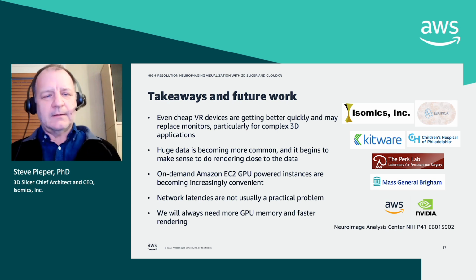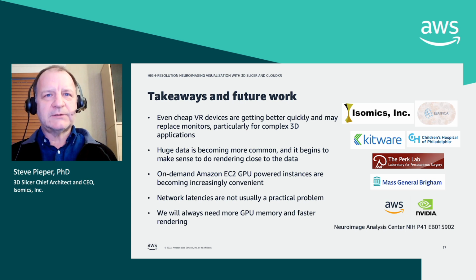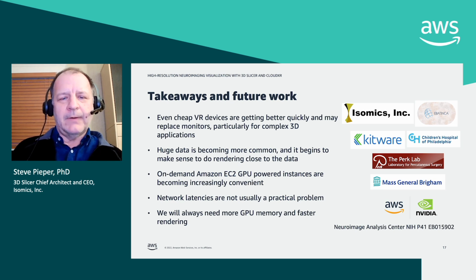In summary, the takeaway from this work is that, unexpectedly, the current generation of cheap VR headsets is actually pretty good. It's getting better very, very quickly. I can imagine a day when I might prefer to wear one for high resolution visualization compared to a monitor. I'm not really there yet because you'd have to wear a headset all day long. But when you need it, it's already pretty good. And I suspect they will continue to get better very quickly. The interactive controllers are already very nice for working on this data.